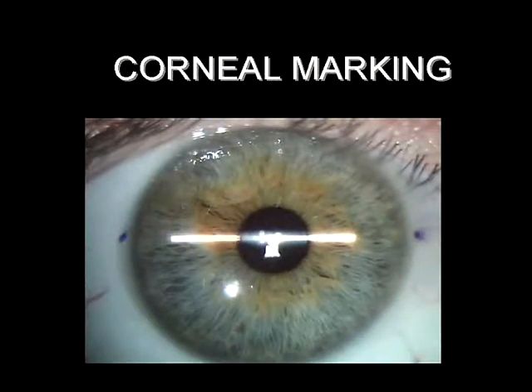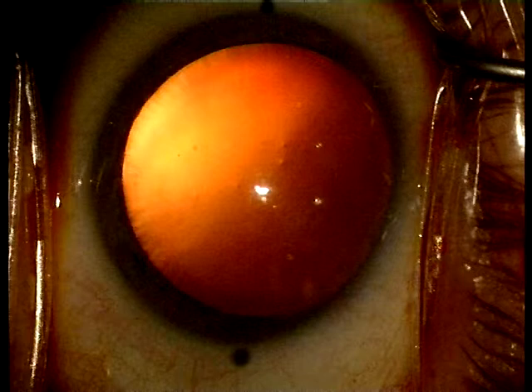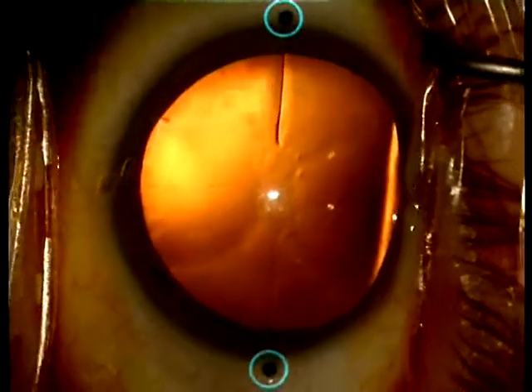Before the patient is placed on the operation table, the horizontal axis is marked at a slit lamp and 2 dots are placed at the limbus. The markings at the limbus indicate the horizontal axis. This axis is highlighted with a marker which is firmly pressed onto the cornea to create epithelial indentations.